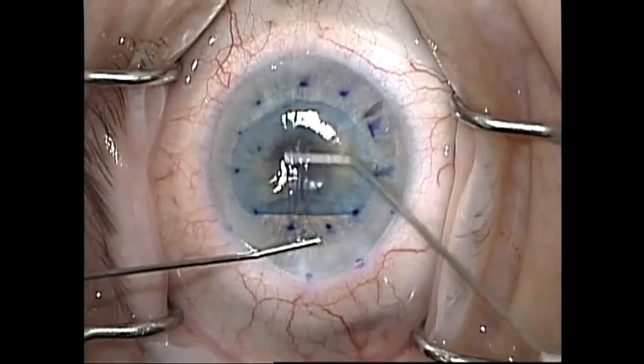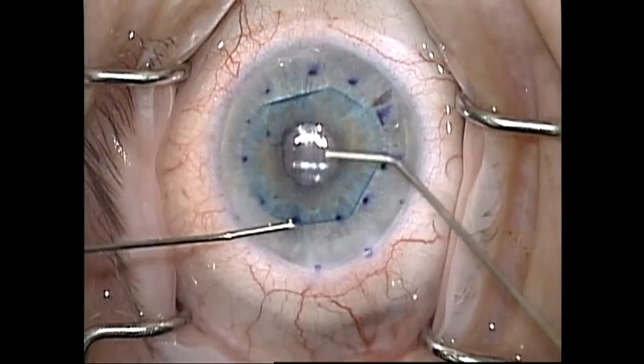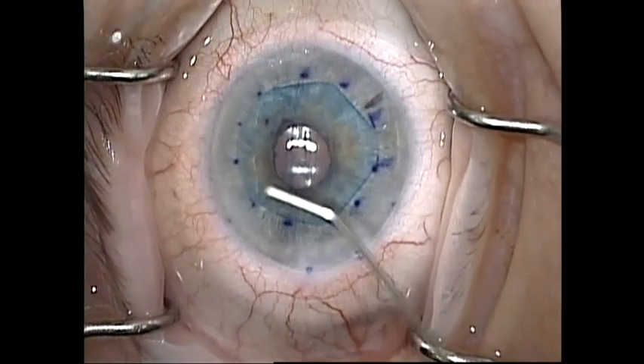I generally use a two-cannula technique to gently unfold the graft. If I'm having trouble unfolding the graft, I pay attention to the depth of the anterior chamber. If the anterior chamber is too deep, tapping movements are ineffectual in unfolding the graft, and if it is too shallow, the graft can be trapped by the iris.